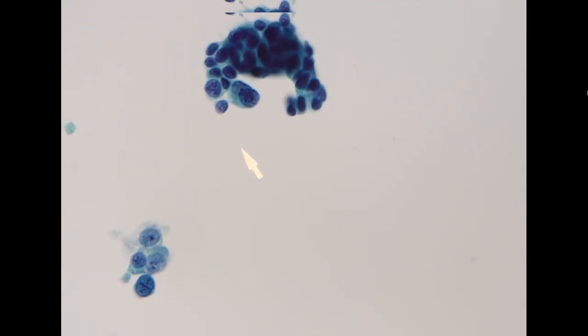In this washing cytology specimen, we start to see more fragments of cells, and we do not see benign intermediate cells, because usually for washing cytology, the washing is targeted at the lesion that they identified by the scope.